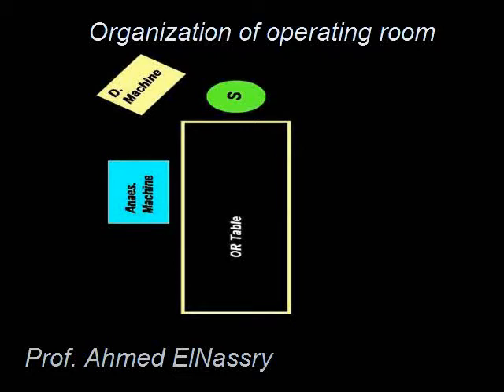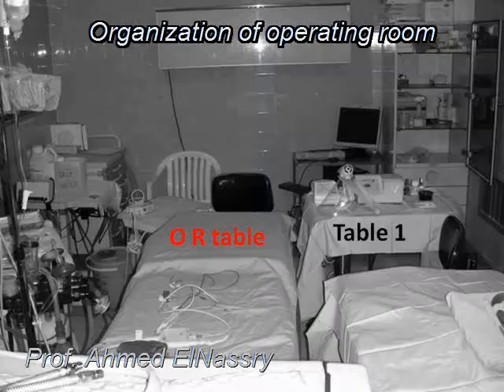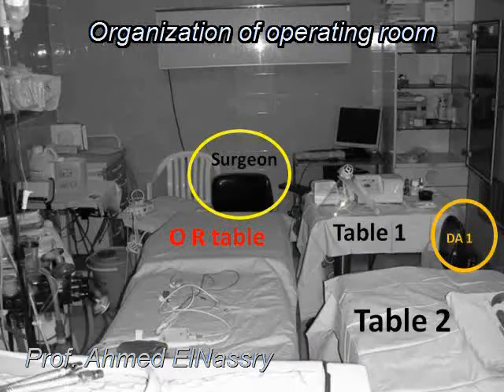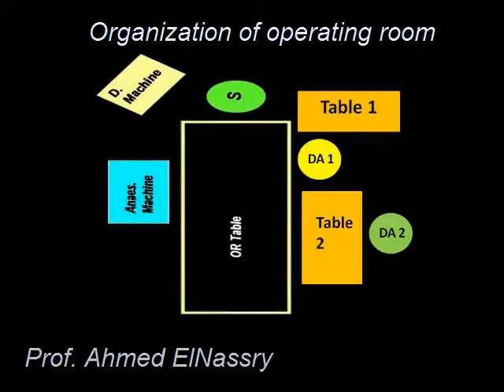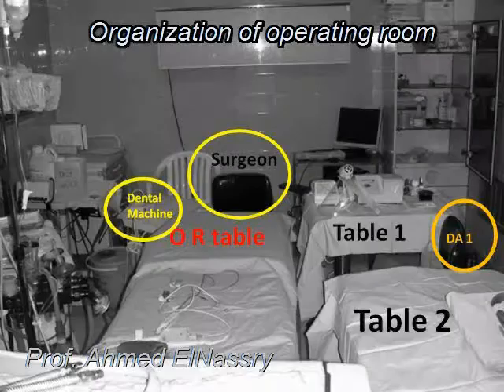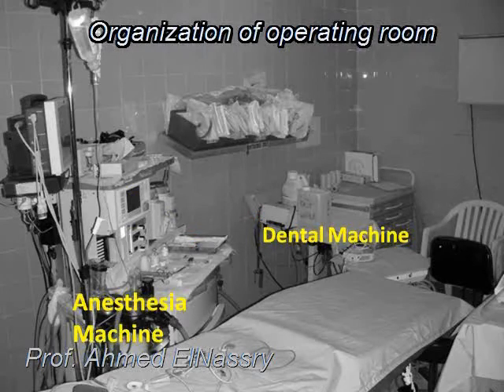This means that on the left side of the patient, we are going to have the portable tables — Table 1 and Table 2 — and the location of the two dental assistants: Dental Assistant 1 and Dental Assistant 2. Dental Assistant 2 will work between Table 2 and Table 1. Behind the head of the patient is the location of the surgeon, and on the right side of the patient is the dental machine and the anesthesia machine.